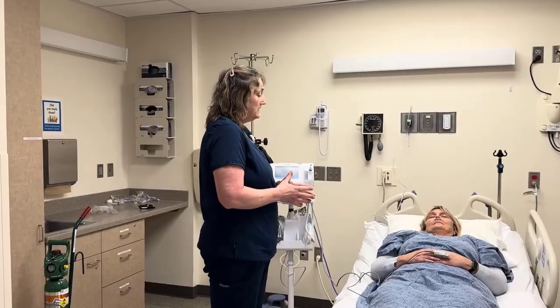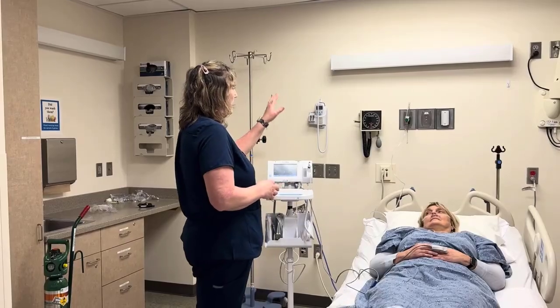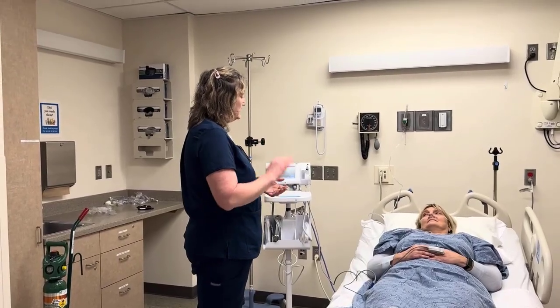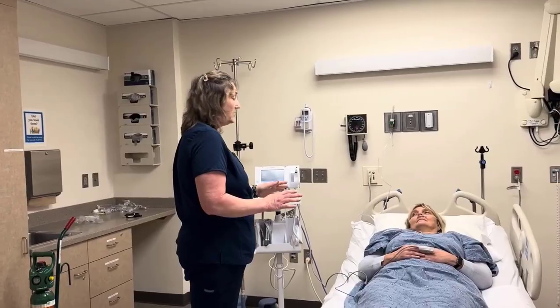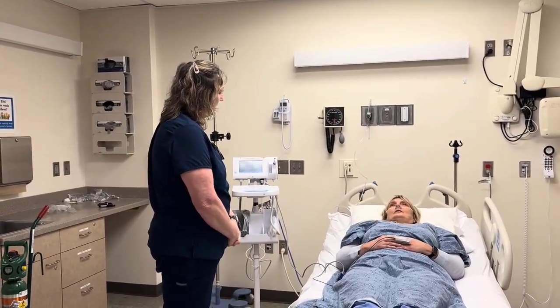Okay. I'm going to be monitoring your oxygenation the whole time. I'm going to turn the wall oxygen off and we're going to see if your oxygen falls. And I'm going to be here to monitor you very closely. Do you have any questions? No, not so far. Okay, perfect.